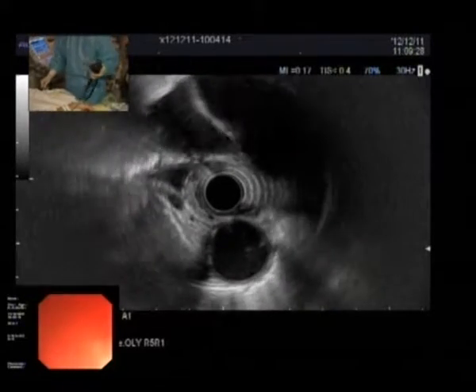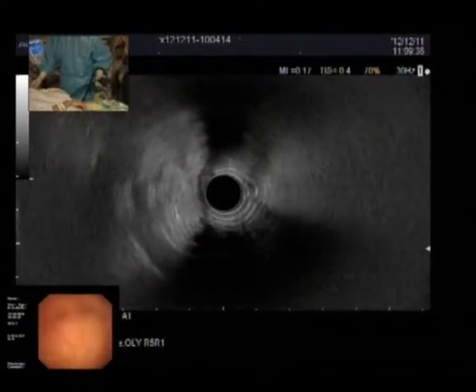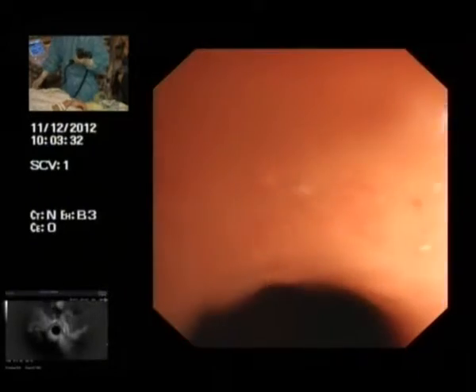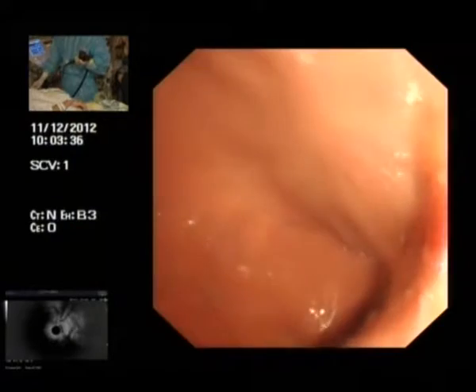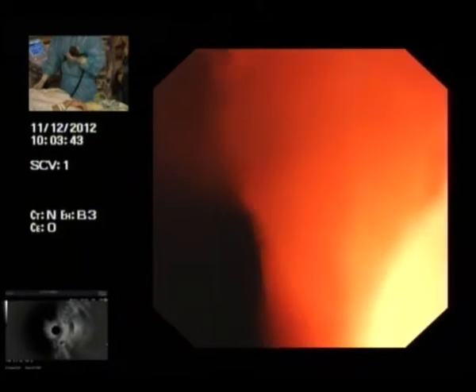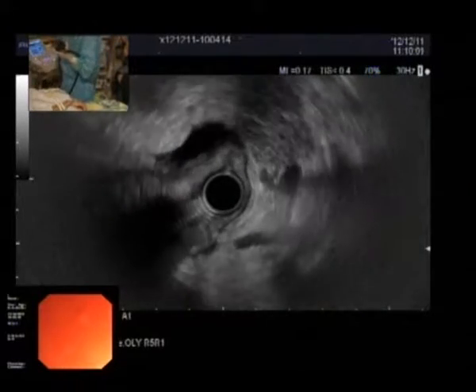Can you also see the endoscopic image now? Endoscopic image, yeah. I push the scope into the stomach here. We can see the antrum, high body and the antrum down there. And if I go into the stomach, by touching the posterior side of the mid-body or lower body, I'm touching it and suction out the gas and start to trace the organs.